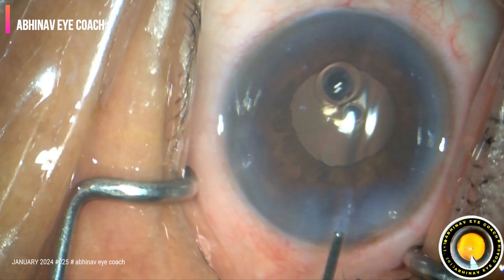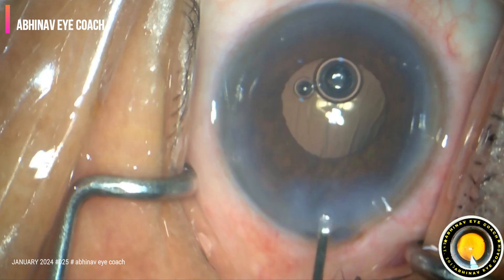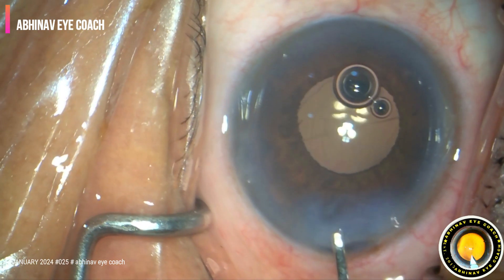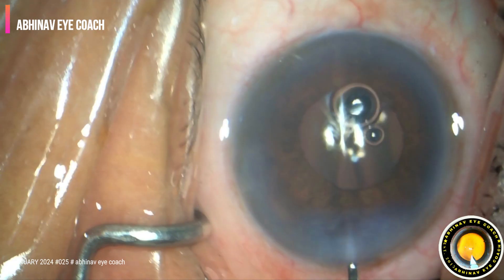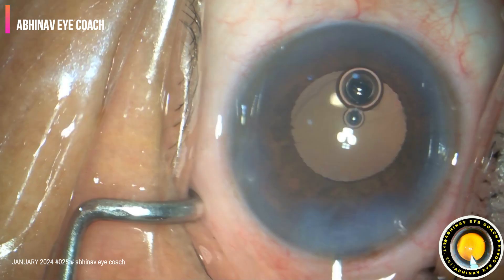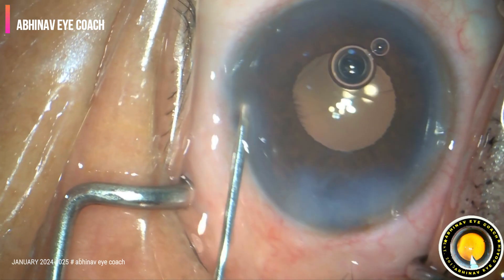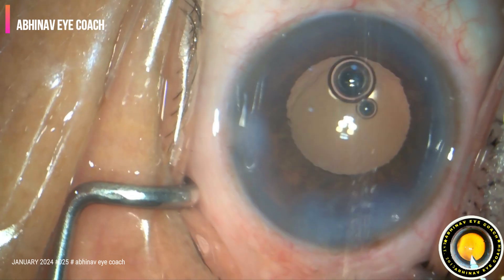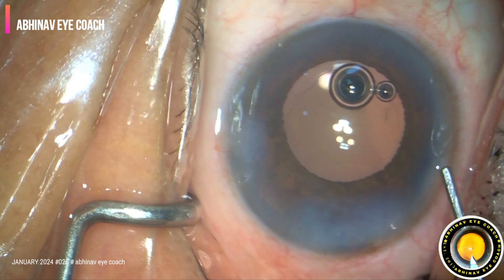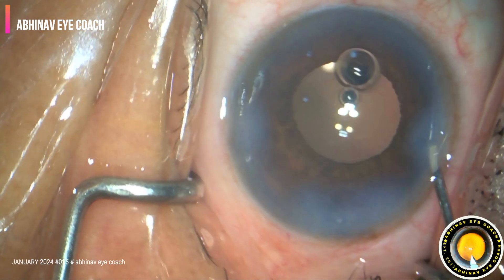The side ports should not be hydrated too much. Only the roof and the entire lip of the main port should be hydrated, so that we can avoid unnecessary astigmatism post-operatively which will take 2 to 3 weeks to go away. The side ports — we should not hydrate them so much that we see a white dot. Just a little bit of hydration is sufficient.